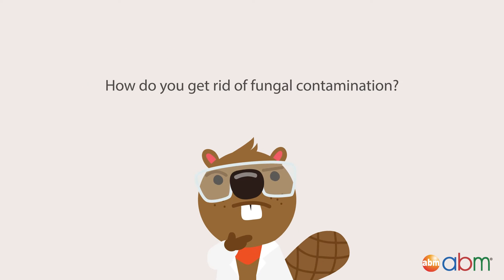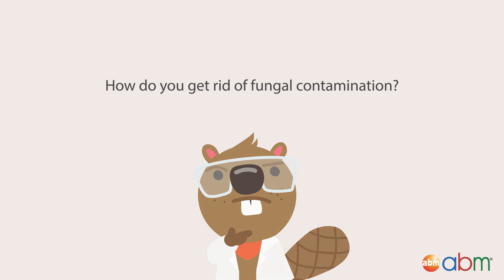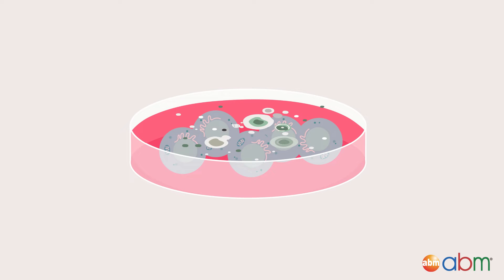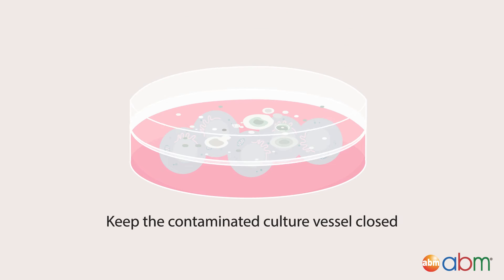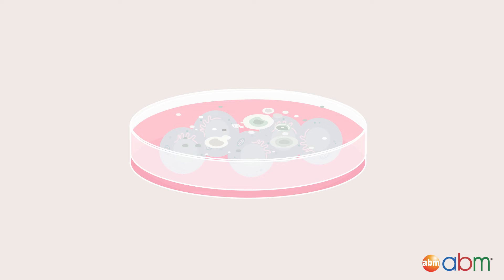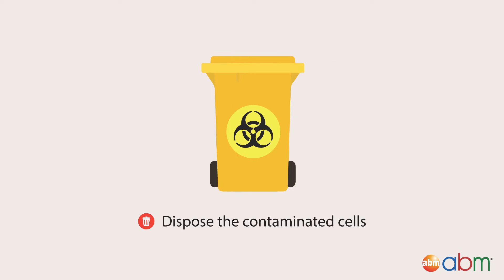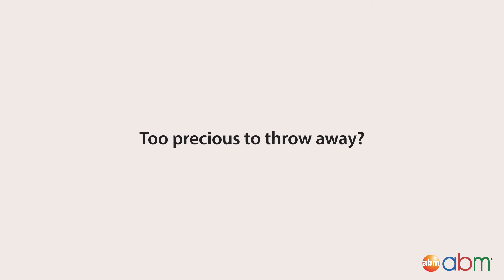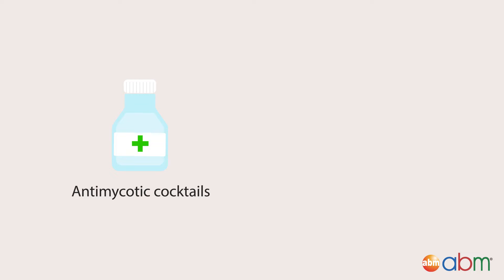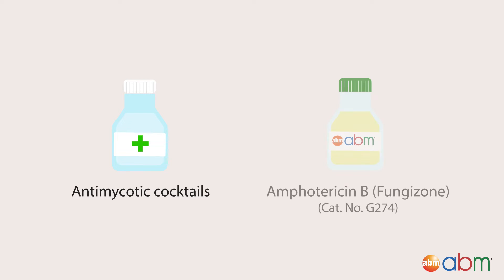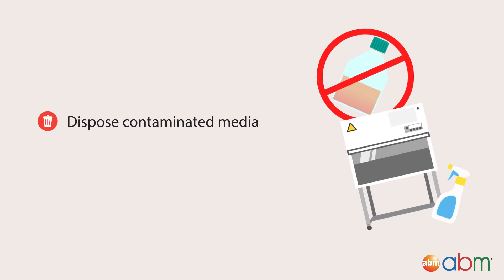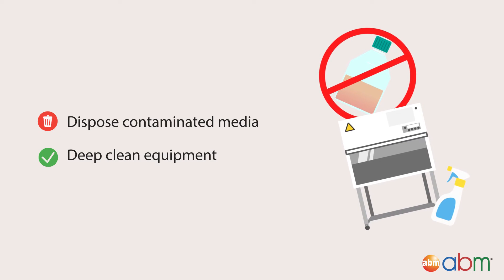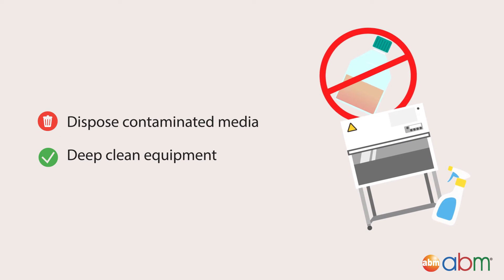So how do you get rid of fungal contamination? Similar to bacterial contamination, it is best to keep the contaminated culture vessel closed to avoid spreading spores and dispose of your contaminated cells if you can. If they're too precious to throw away, you can try using anti-mycotic cocktails or add an anti-fungal like fungizone, which contains amphotericin B. You'll also need to throw away your contaminated media and do a deep clean of your equipment to ensure all fungal spores are removed.